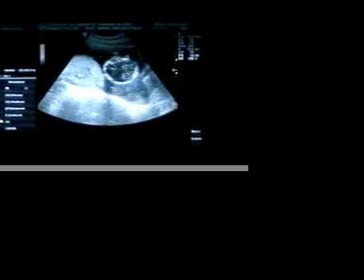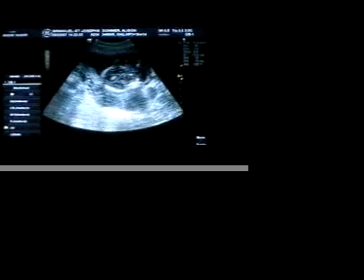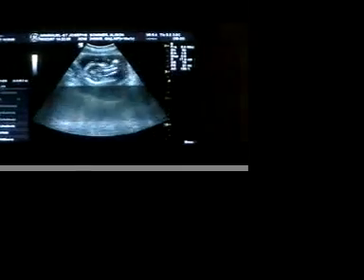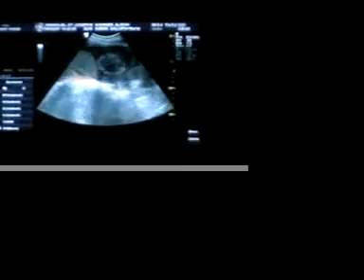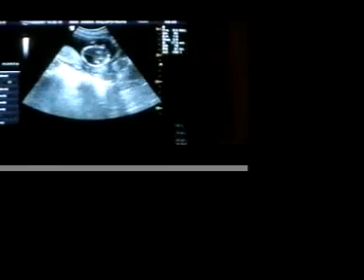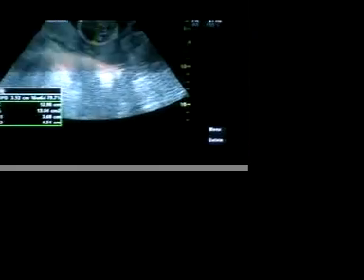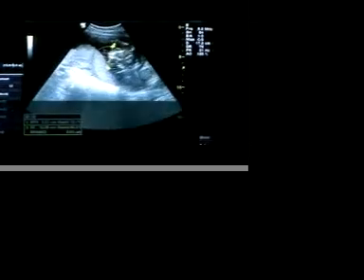Sometimes if we just do this little gentle bounce, it's enough to get the baby to open its legs. So I'm just going to try and get a view so I can take some measurements so we can see how big the baby is. Baby's kind of rolling its neck to one side, so we're not going to get a perfect measurement, but I'll get pretty close. And then I have to measure baby's tummy.